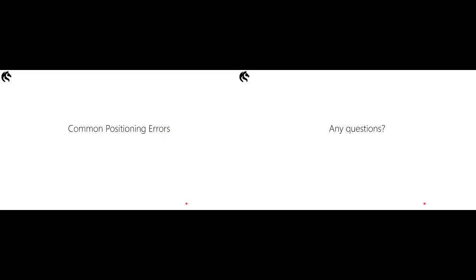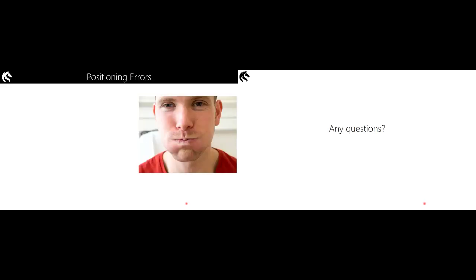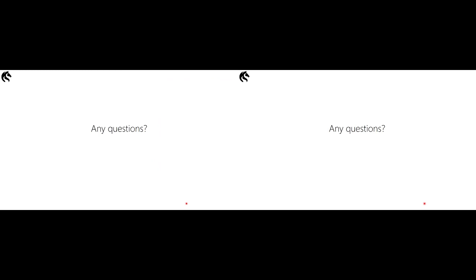There you go. Common positioning errors. Okay, so ribs. Should you do inspiratory or expiratory? Should you do both? If you've got one at the level of the diaphragm, should you do both views to be able to show it? Maybe. Sternum, have you rotated the patient enough to project the sternum free of the spine? Very small angle. And have you coached for the Valsalva? If you do those three things, the majority of your positioning errors are going to be dealt with. Any questions about any of those things?